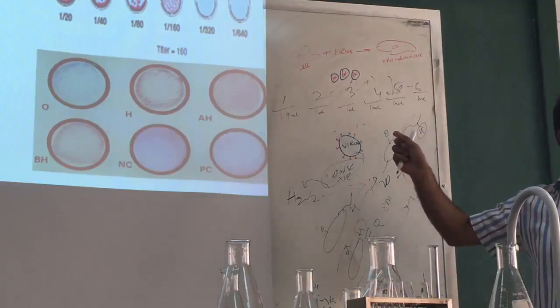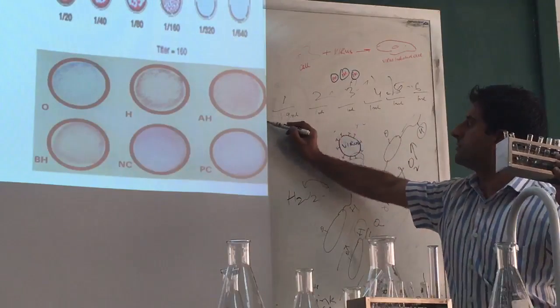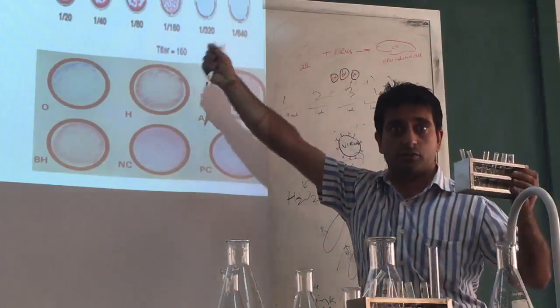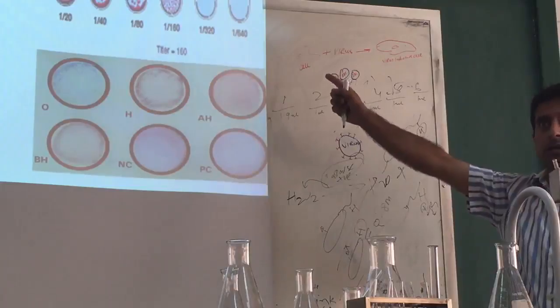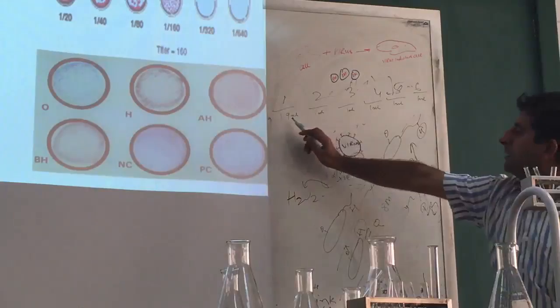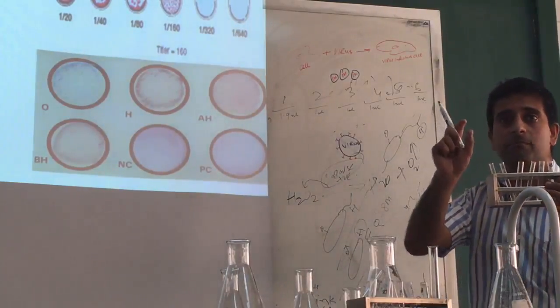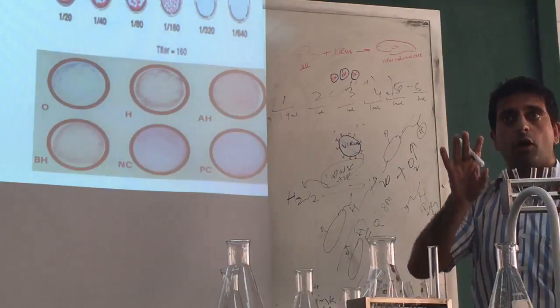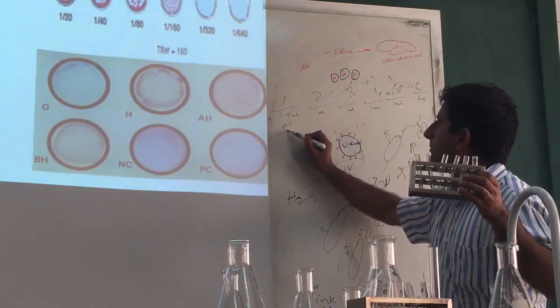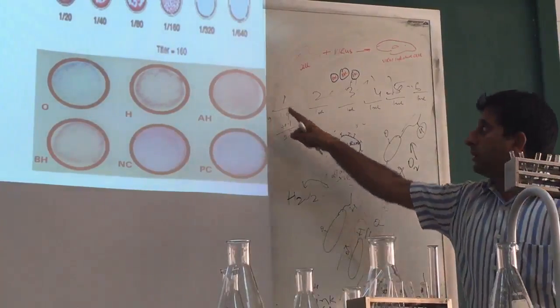I hope you are understanding it, okay? From here 1.9, you put the normal saline, 0.9% sodium chloride, to perform this test. To perform the Vidal, this is finished now. We'll talk about the Vidal test now. So next step, you will put the serum of the patient, the sample, here, plus 0.1 ml. How many ml total? 2. Correct. This is now tube 1.